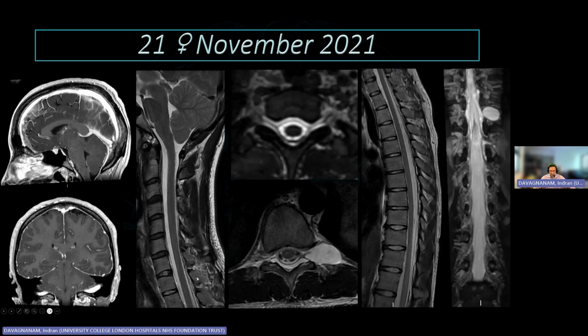She had quite a large collection, longitudinally extensive, both ventral, so in front, and at the back within the epidural space. And you can see that on the cross-sectional views, where you've got these sleeves of CSF on both sides. And as we scrutinized the spine, once we got to the lower thoracic region, on the left side, you can see that this large meningeal diverticulum was there.